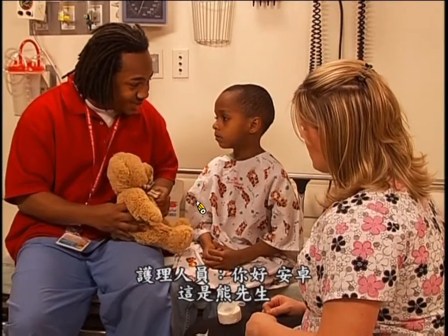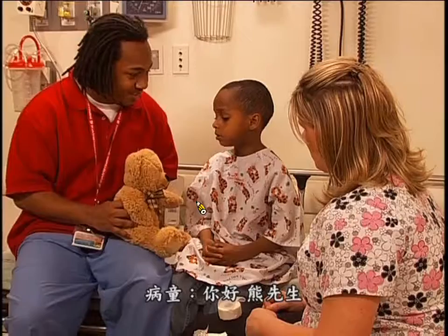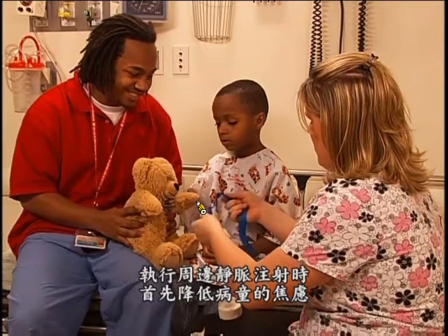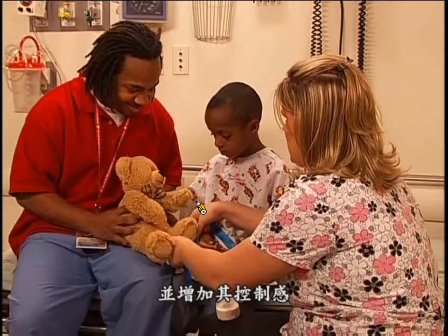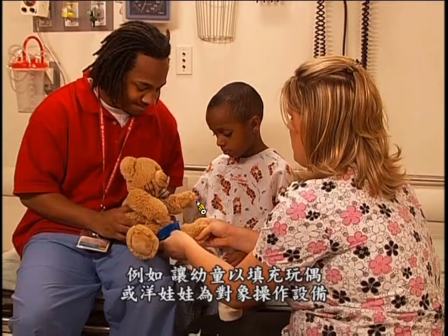Hi, Andre. This is Mr. Bear, and we need all those things for his IV. Hi, Mr. Bear. To access a peripheral vein, first reduce the child's anxiety and increase his sense of control. For example, let a younger child play with the equipment, using it on a stuffed animal or doll.